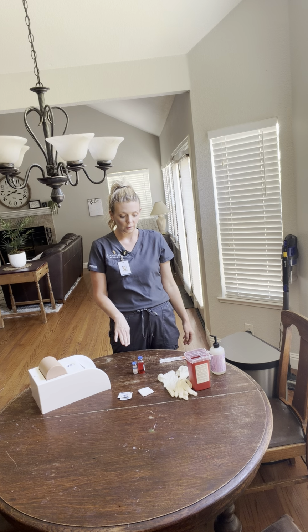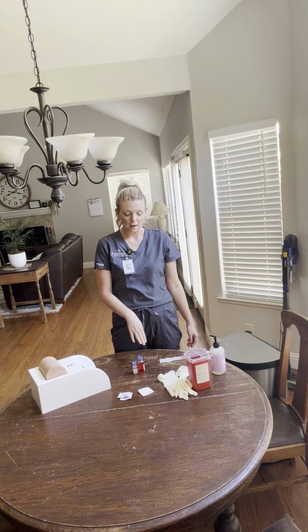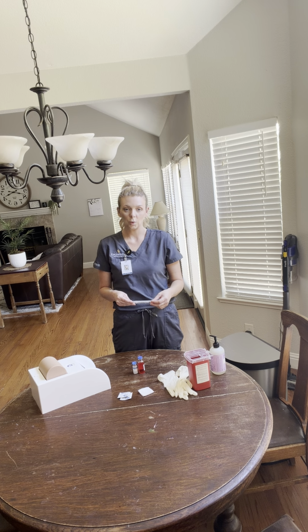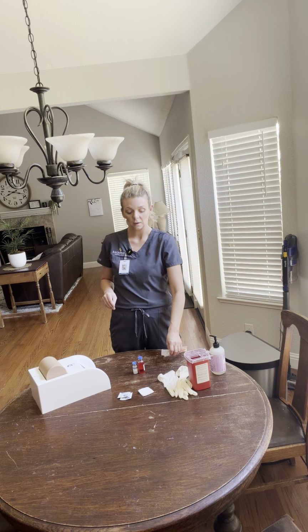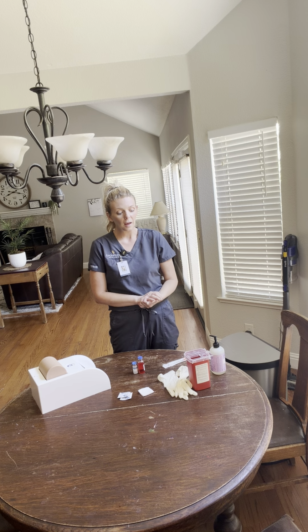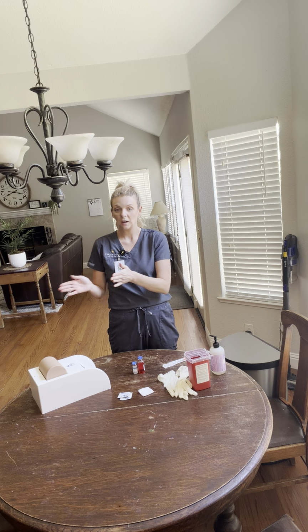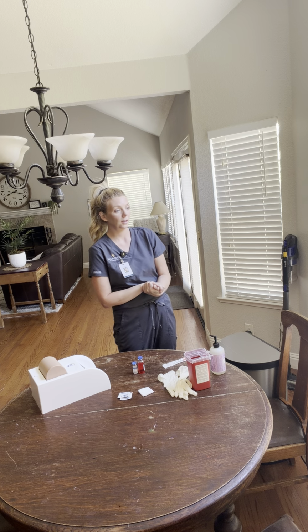I have my regular insulin and my NPH. I have my insulin syringe, which is a 29 gauge. It is a 1/2 inch needle and it provides 100 units, which is 1 milliliter. I have my gloves, my hand hygiene, my trash can, my sharps container, and of course my patient here.